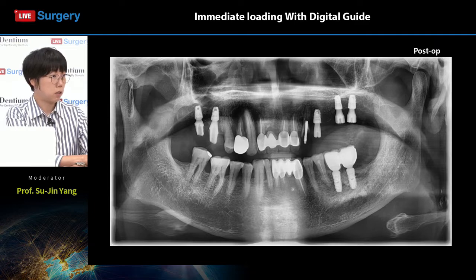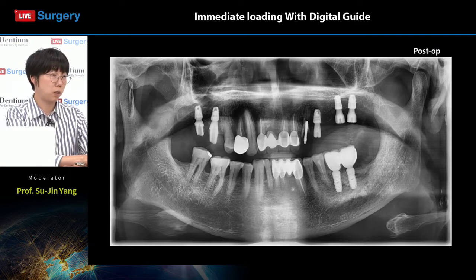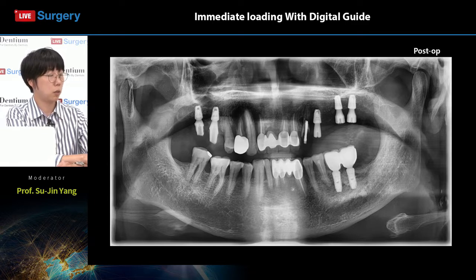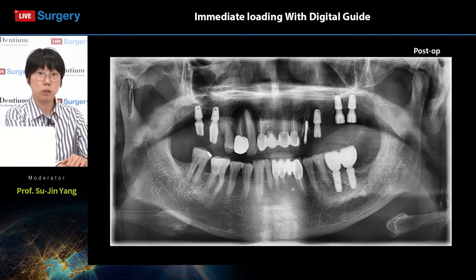And since Dr. Lee has only performed the provisionals on the upper right side, he will have to check the initial stability or the stability gain on the upper left and proceed with the temporary bridges within a few months. It takes time, usually about 3 months to 6 months maximum, according to the patient's status and medication or medical status. Okay, so now we will move on to the Q&A session.